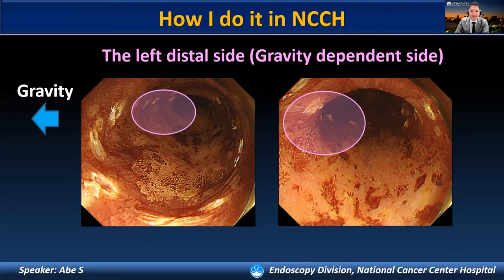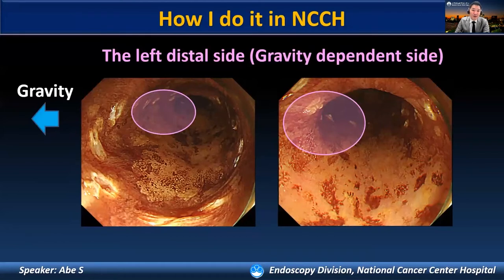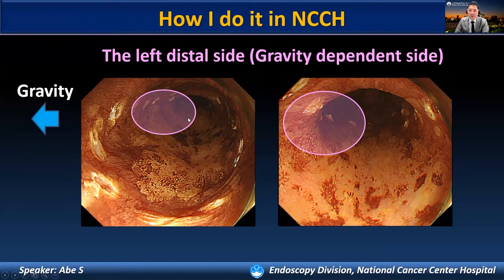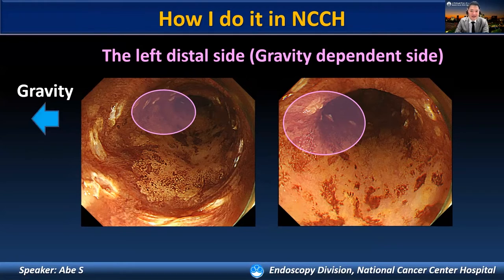The next tip: during esophageal ESD, we need to consider the gravity direction. The left side is the gravity-dependent side when we perform ESD in the left lateral position. As we continue the submucosal dissection, the lesion gradually shifts distally and towards the left side due to gravity. Thus, the distal left side is the most challenging part. If you leave that area for the end of the ESD, it will be very challenging to obtain sufficient traction and identify the edge of the submucosal.